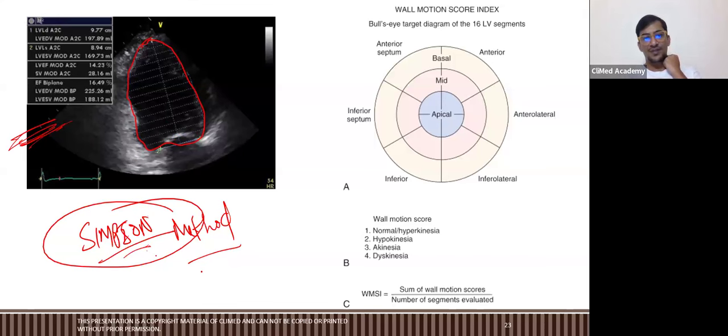What is the main principle of detecting different heart abnormalities during echo? The principle of echo is sound, just the sound of the blood flow. This is to check heart failure, right? And this is to check myocardial infarction based on the thickness and the motion of the wall. There is a scoring system, we call it the wall motion score index, based on where the wall motion is low or higher.